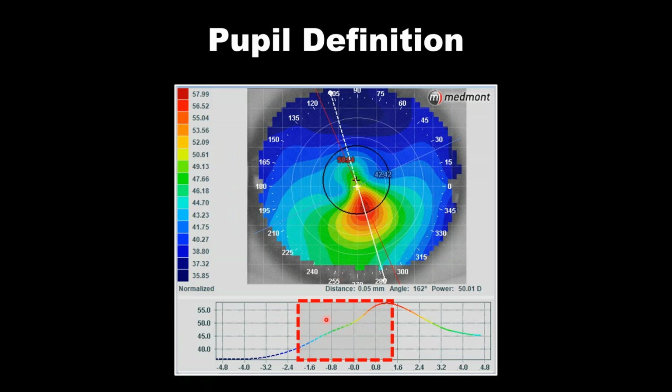And that gives us an appreciation that this eye goes from approximately 40 diopters to somewhere in the neighborhood of 58 diopters roughly. There's a big spread in power between the most plus and the most minus within this eye.